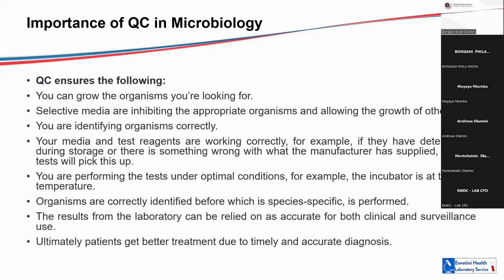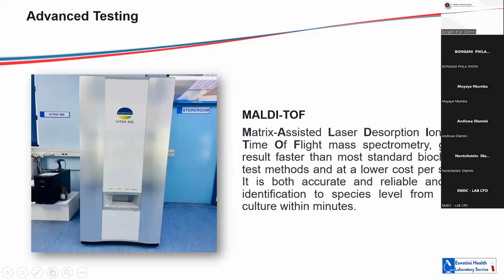So here we have a picture of what's called a VITEK MS. It's one of the new testing platforms which are used in the microbiology lab here in Bavane.